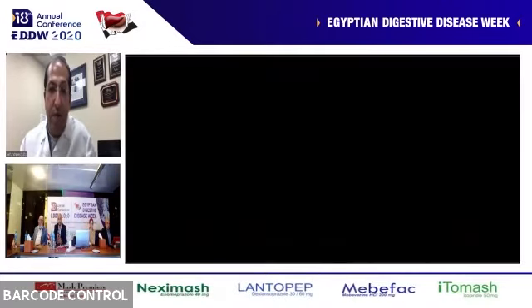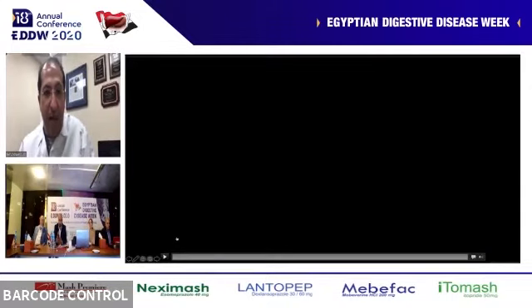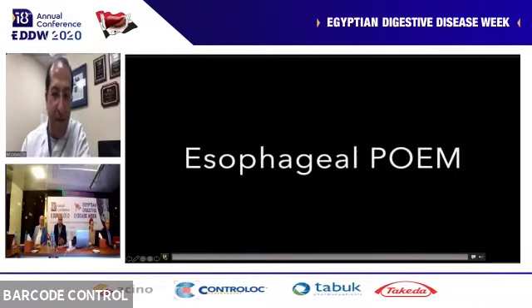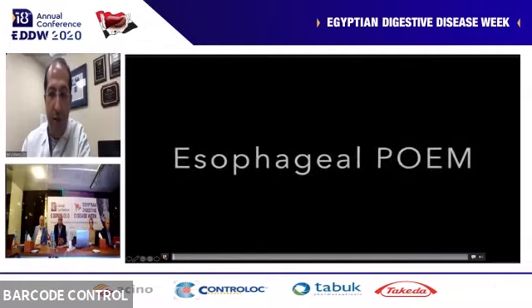I'd like to show you some videos. I did a little bit of a lengthy video because I wanted to show you the techniques, but I'll try to skip a little bit. I don't want to take a lot of time. I was only given 15 minutes for this talk. So this is just to show you the POEM.